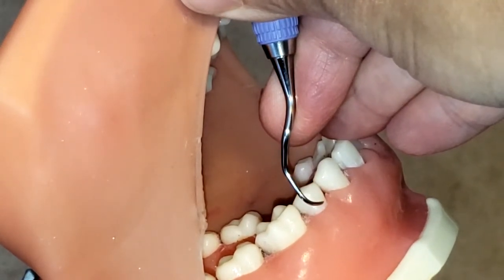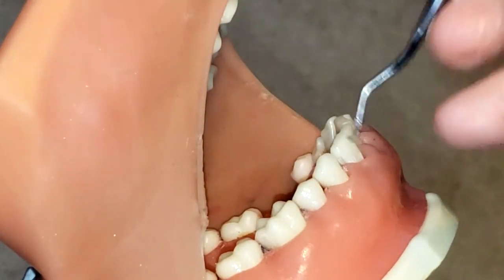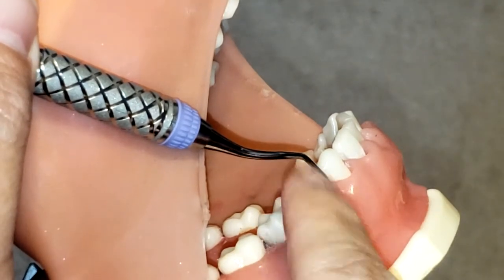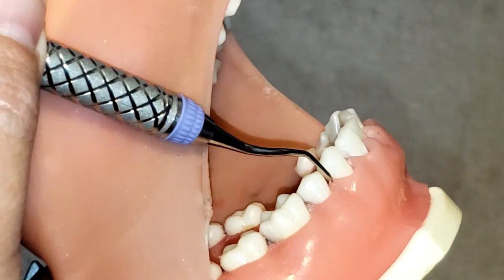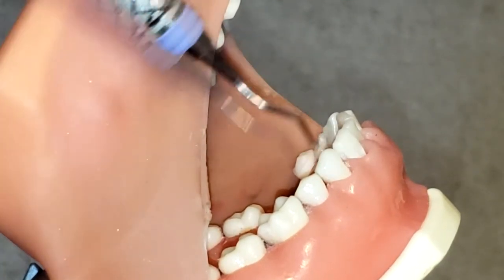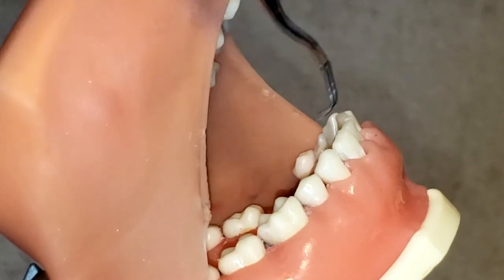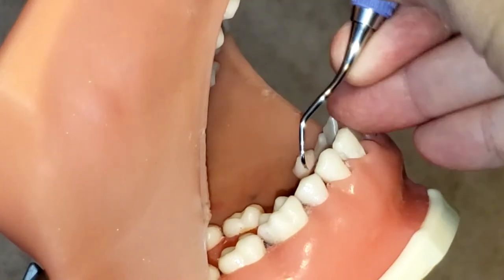You can tell this is the correct working end because it also hugs the mesial — if you put it on the face of the tooth, it would hug the mesial and the point will not be sticking out. If you use the incorrect end, even if you try to angle it so the lower shank is parallel to the long axis of the tooth, you'll still get that V pointing towards the mesial of that first premolar, which is incorrect, and the tip points outward.